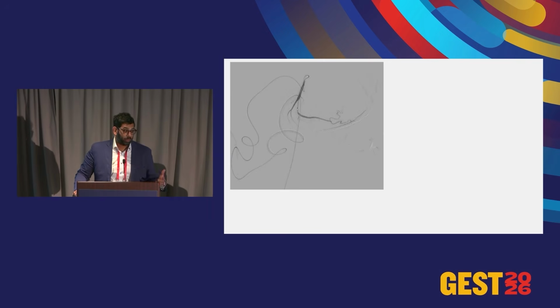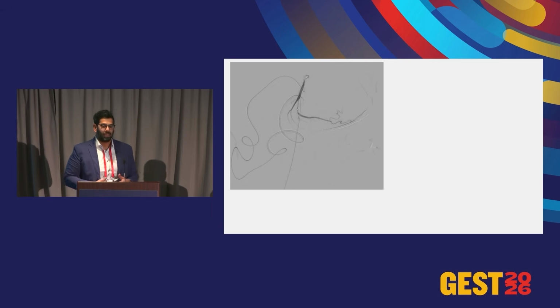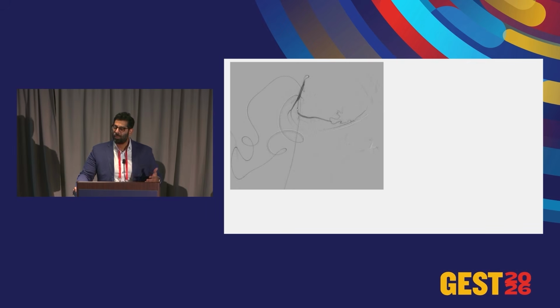And again, my plan was left gastric and gastroepiploic. Those of you that know me, my starting catheter, except in very select situations, like proximal spleen, internal iliac embolization for trauma, maybe variceal bleeding, BATO, BRTO, where I might start with a 2.8 microcatheter, base catheter, microcatheter combo. But everything else in my practice, I start with a 2.0 or below. It's very common for me. You get great injection rates, I can get anywhere I need to, and I can deliver most of the embolics that I need to. And I'm a primary liquid user at baseline, outside of the MSK space, right?